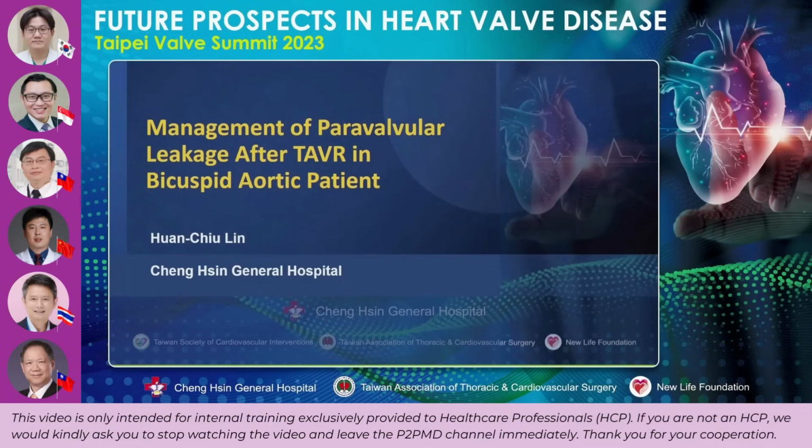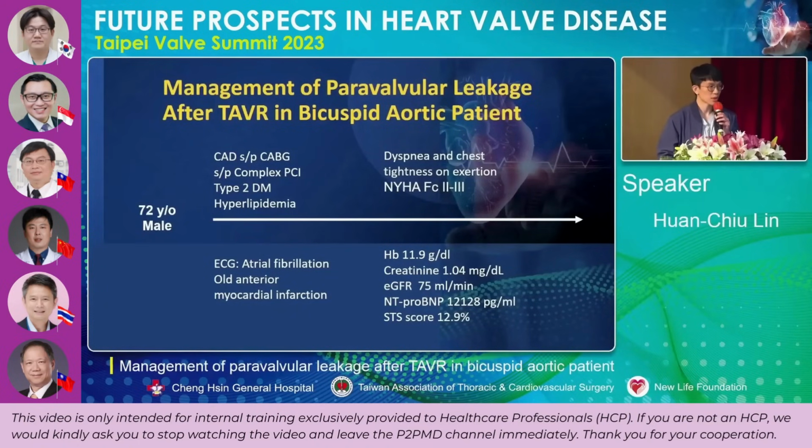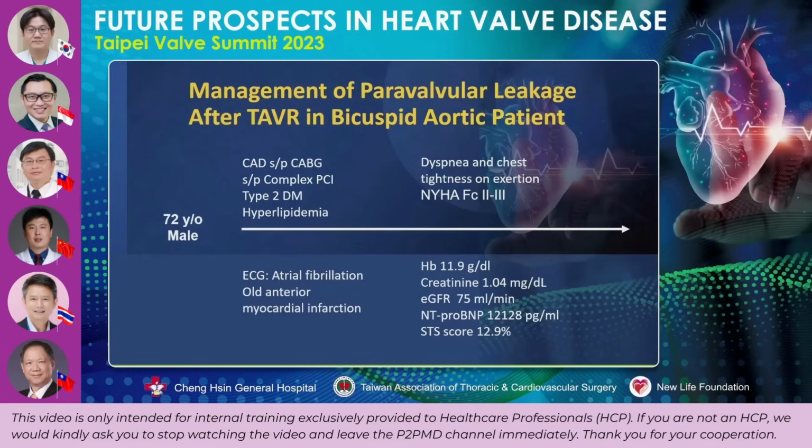It's my great honor to share a case on the topic of management of paravalvular leakage after TAVR in a bicuspid aortic patient. We came across this 72-year-old male who had a history of severe calcified coronary artery disease and underwent CABG and complex PCI several times.